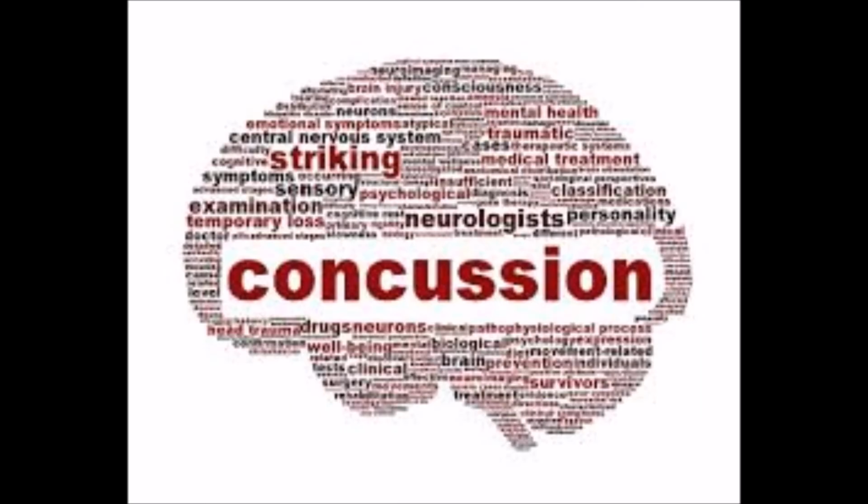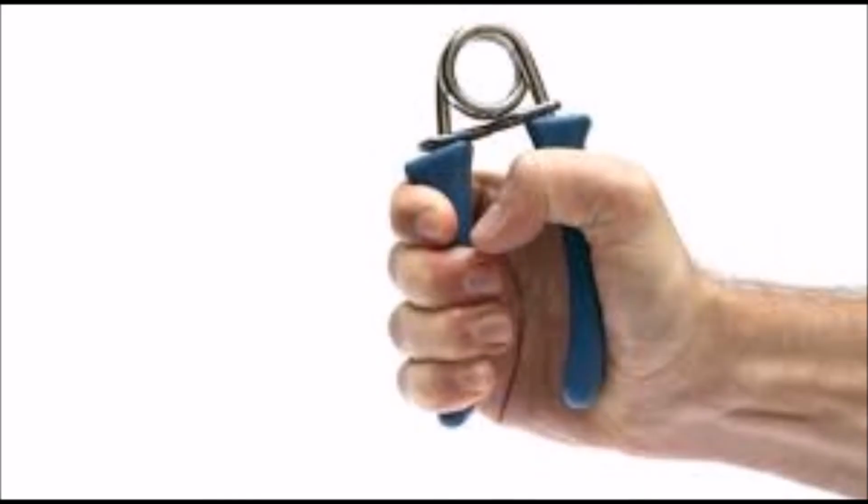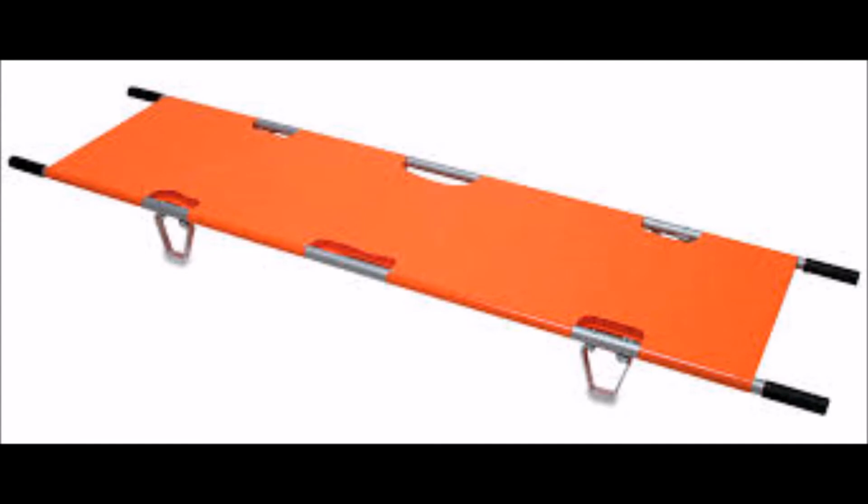This will reduce the amount of safety hazards, such as inflicting further injuries due to rough movement, possibilities of the casualty falling off the stretcher and causing head injuries due to excessive shaking. The handles will be perpendicular to the bed frame, meaning it will no longer follow the orientation of the frame. This will allow improved grip and will allow the medic to carry a stretcher easier and carry a casualty without any issues.